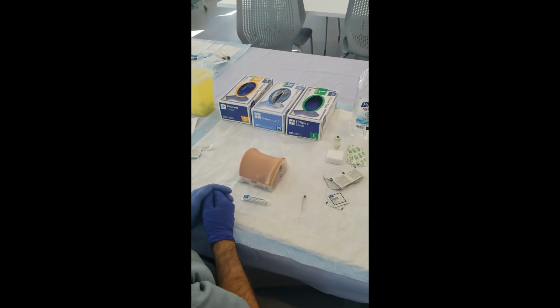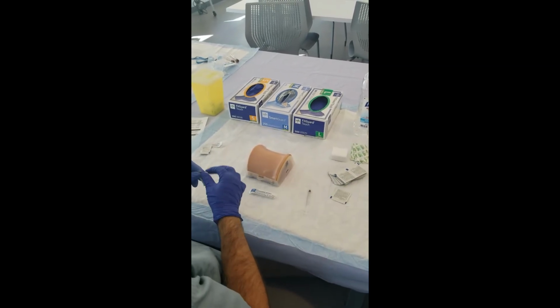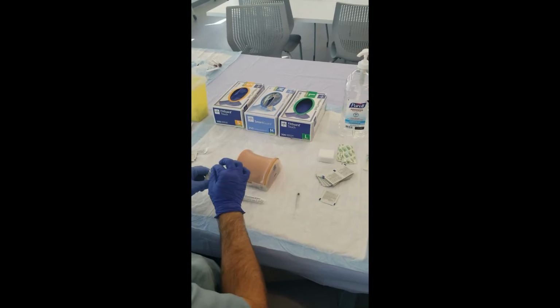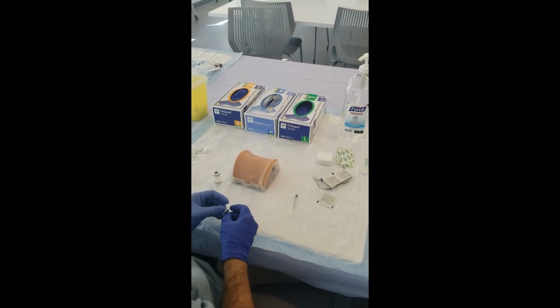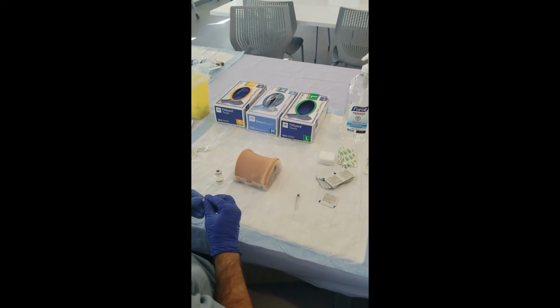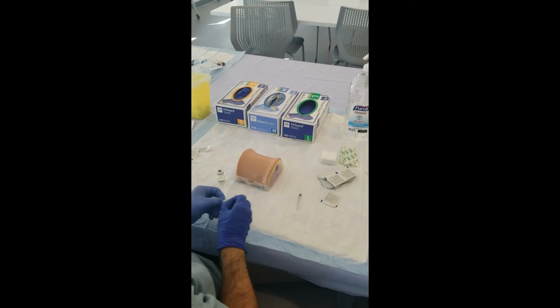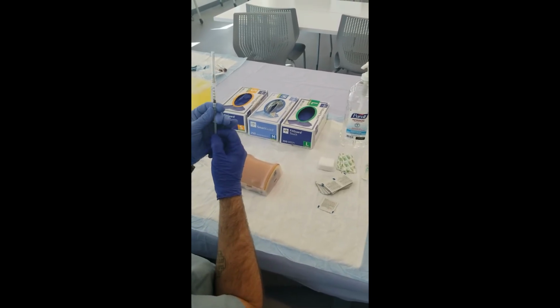Step 36. Opened vial and cleaned with an alcohol pad. Step 37. Withdrew correct volume of medication, 0.5 ccs, and removed air from syringe. It is helpful to first inject 0.5 ccs of air into the vial, then draw up the medication.